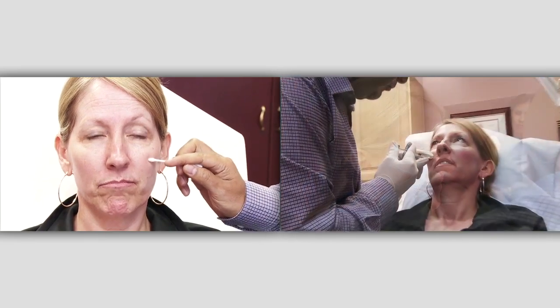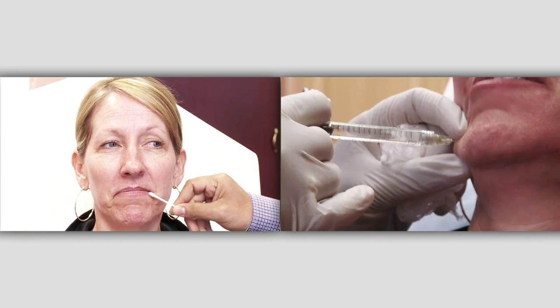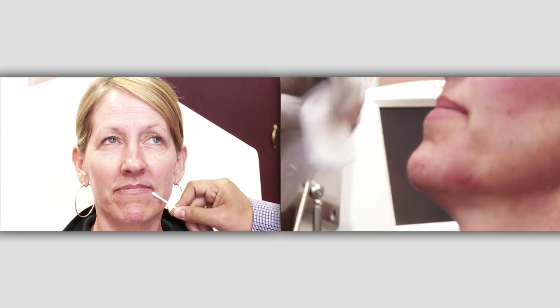Down here, we start to deflate, where the cheeks start to go down. They make their way down to this area, which also creates this fold in there, the nasolabial fold. So that's where we put some Juvederm. And you can see when she was animating, you see these strong lines down here and what we call the mentalis. And this creates more of that marionette line that a lot of women don't like. So by using Botox in this area, a little bit here to reduce the movement of these muscles, and some filler in here, here, and also in here, will give her a very nice soft lift.